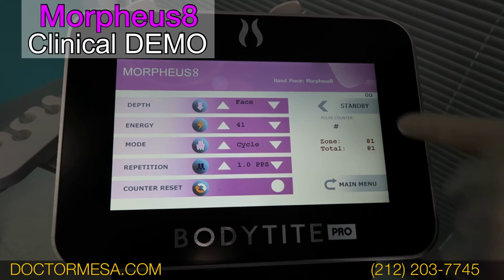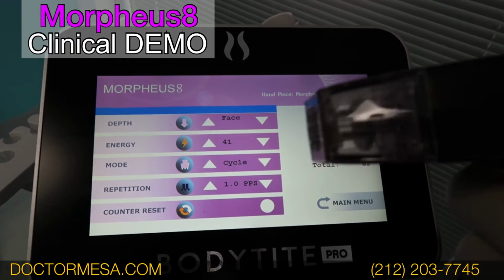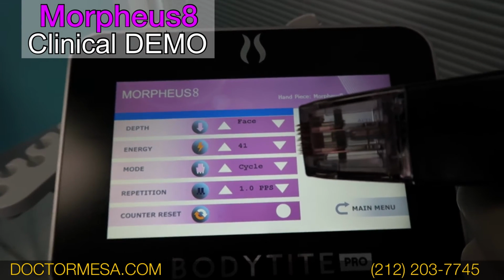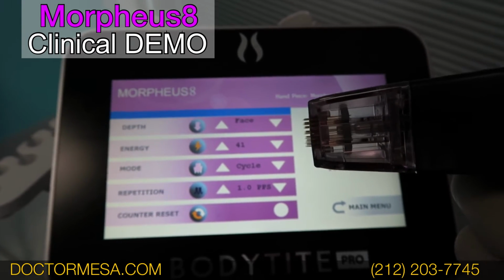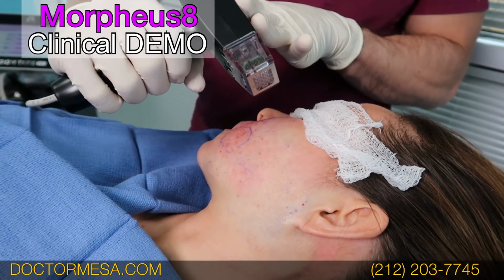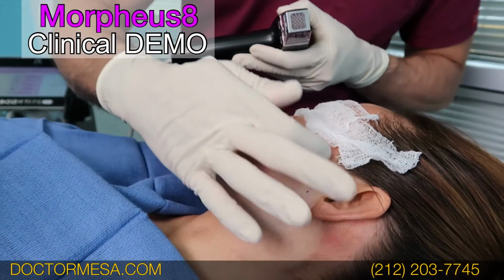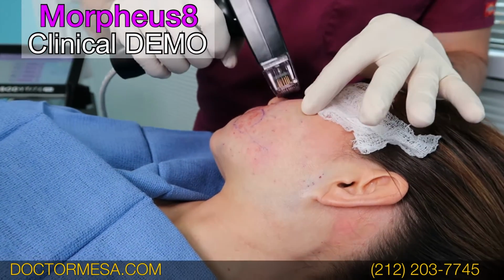And I'm going to show you here when we do this clear. This is where the needles are going to go in and out, just 3 millimeters. They go just on the skin. Okay, so now that we have the Morpheus8 in the skin tightening device that is basically built-in Fractora, we're going to treat all the area of the face. I'm going to start here.